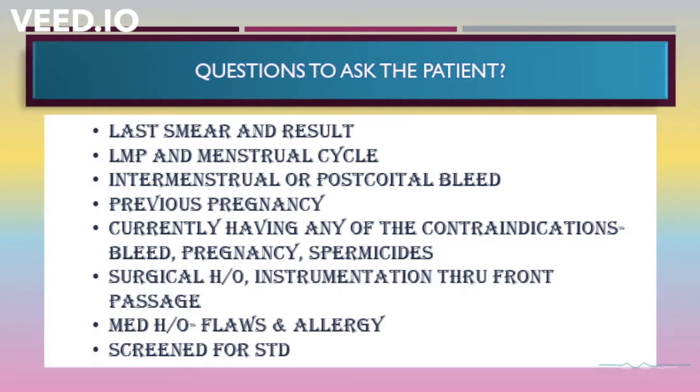What are the questions to ask the patient? When was the last smear done, and what was the result of the last smear? This question is for two reasons. One is to understand whether the patient has already had any result, and secondly, to know whether the patient already knows how this test is carried out, so that when you're explaining the procedure, you may ask the patient if she would like full detail of the procedure, or she would like to skip that. So it only depends on the patient.